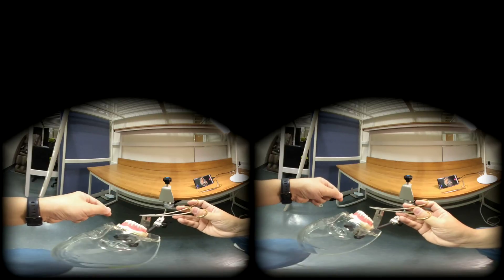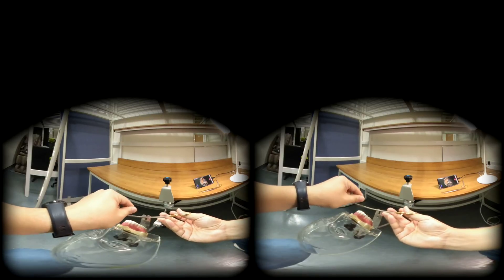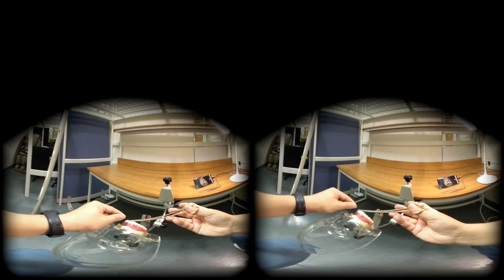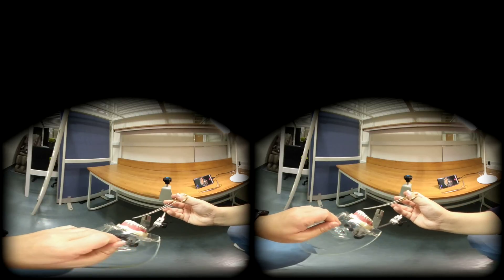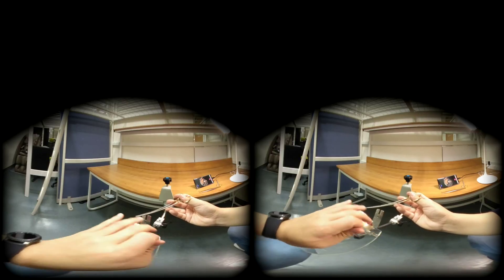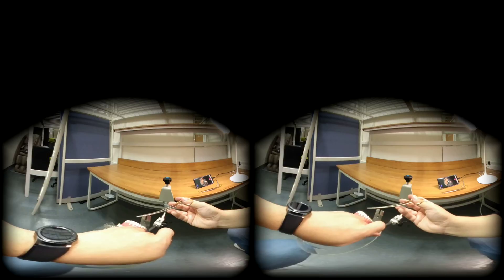This is the surgeon's knot, so the first throw will be twice the rotation. Rule number one: needle holder goes above the incision line. Rule number two: it rotates around the needle holder with the needle holder inside the loop. Rule number three: it grips the tip of the short end suture, and the short end crosses the river above the incision line, and your left hand goes the other direction. Your left pinky goes like this, and you pull it until you have a tight knot. Now let the short end go.